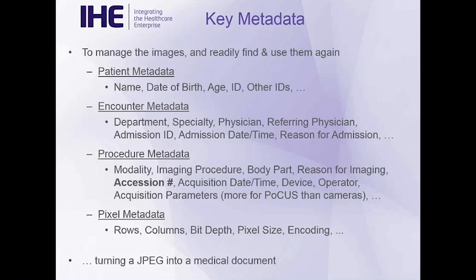And one of the things we've done is to continue, even though there's no order, to continue to generate an accession number for these, because for a lot of the imaging management parts of the EMR, the accession number is how they index these and how they then call up viewers within the EMR based around that.